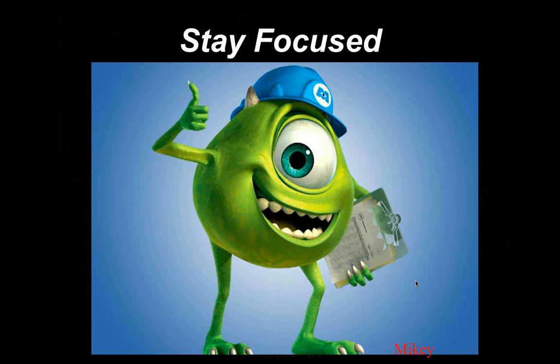I think that's well said. We do have some questions. Debbie has a good one. She's one of our outstanding residents, and she had a question about scleral lens designs and any preference for the semi-sclerals, which she defines as like the 14.3 to 15.6 type diameters, versus the larger, like 18 millimeter or greater diameters. She sometimes finds some mid-peripheral indentation staining on the cornea with the smaller designs. Have you noticed similar problems with fitting the semi-scleral?